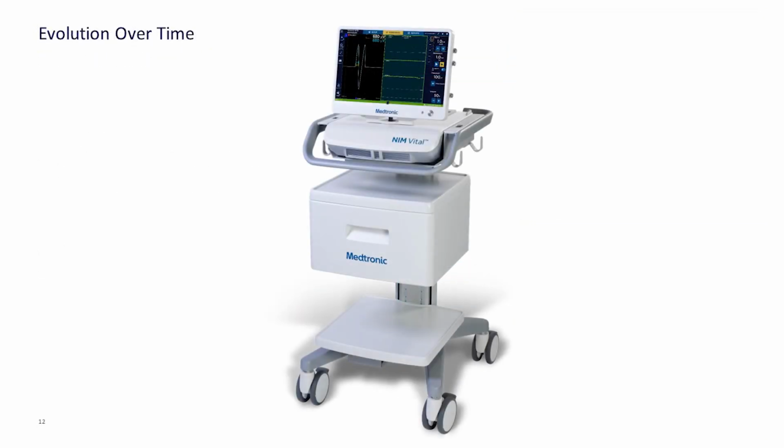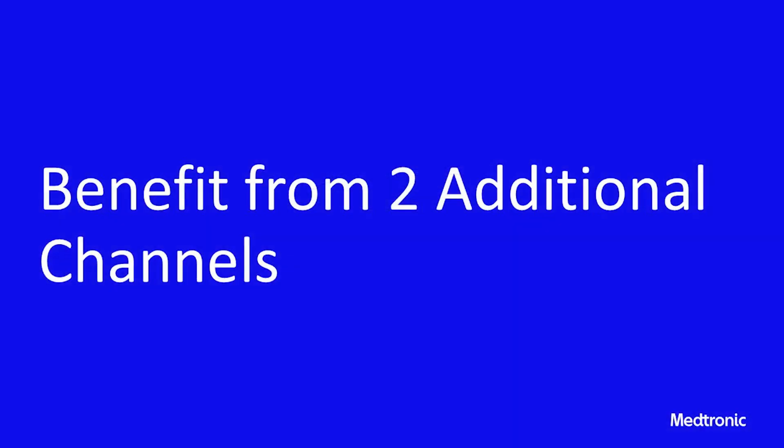With time, however, 4-channel and even 32-channel devices became commonplace, and therefore we are now making recommendations for 4-channel monitoring being the routine. The question, therefore, is how to best benefit from the 2 additional channels. The following, therefore, represents strong recommendations for the use of 4-channel facial nerve monitoring.